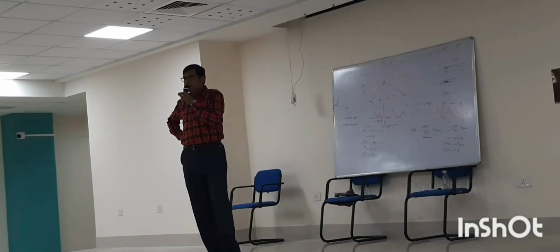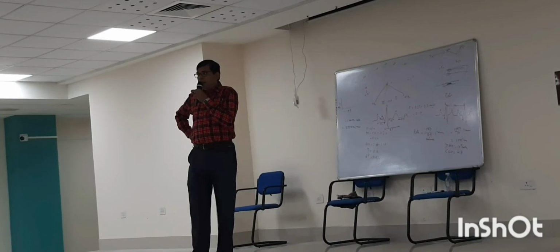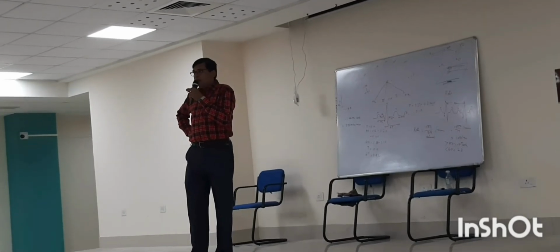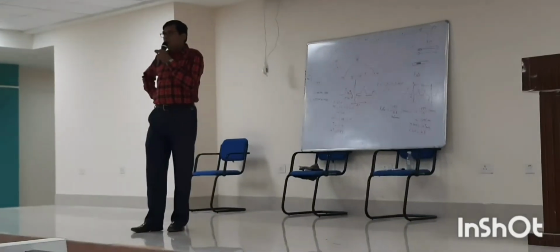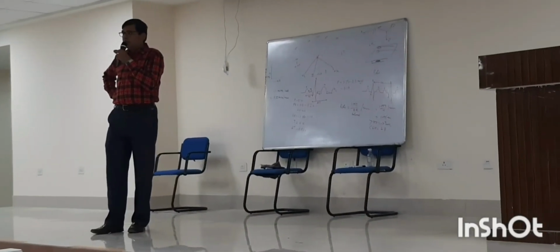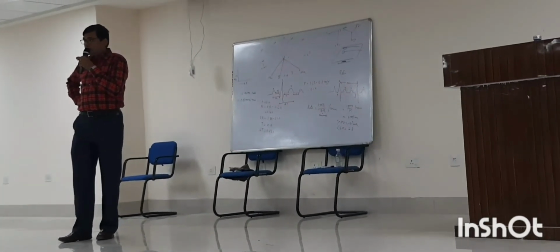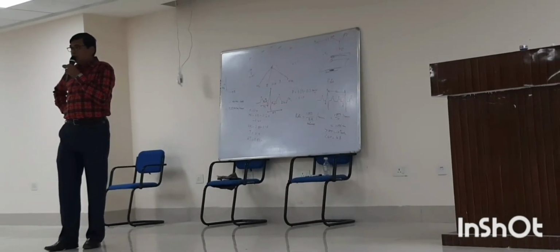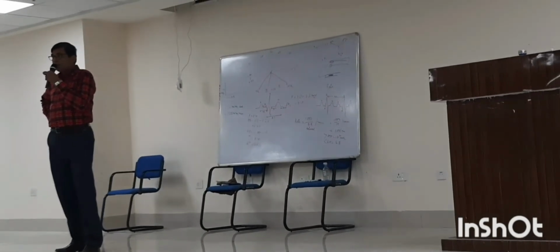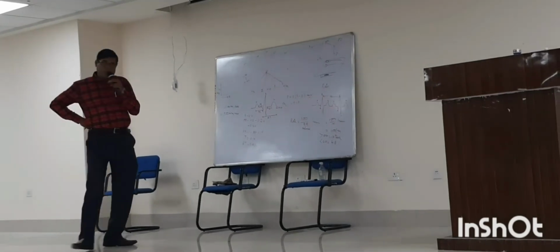How many positive small squares are there? Negative. Net minus 1. Plus 1. Is the R wave tall or the S wave tall? Negative. Minus 1.